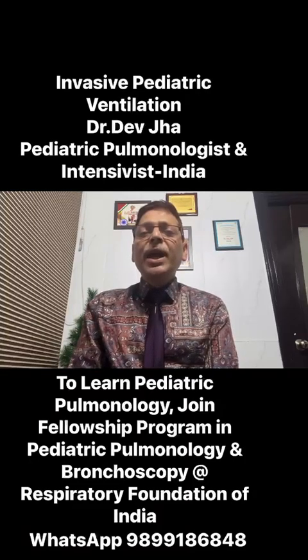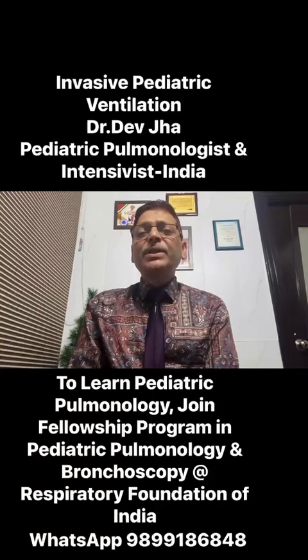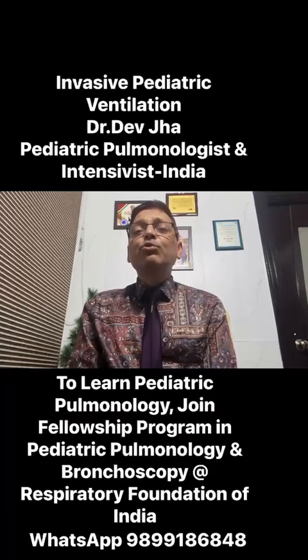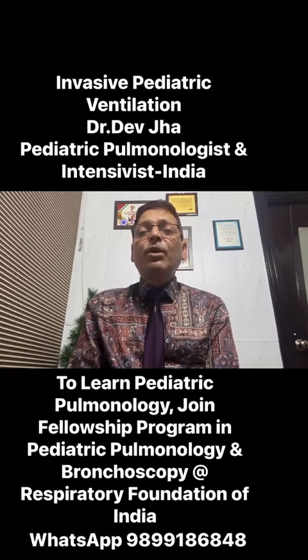And if everything is triggered by the patient, limited by the patient and cycled by the patient, it is called a spontaneous breath. So this is the basic concept. And limit is what? Pressure limit usually, or volume limit. So this is the usual concept of breath. With this concept we have to operate ventilator for the treatment of children on ventilator.